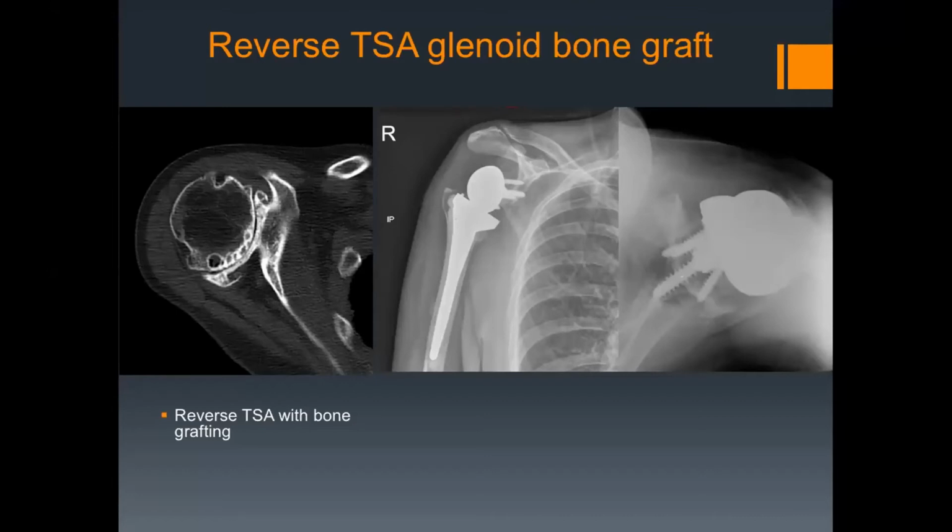I think the view on the left looks in essence too severe, because at the bottom of the glenoid you do have some bone. She's rheumatoid, hence why we've cemented the stem. Her bone wouldn't have been good quality for a short stem, which you might see in others. But it's all about trying to correct that inclination and version, and fill what was a massive posterolateral defect in her glenoid. Hopefully this bone will then integrate with her own.